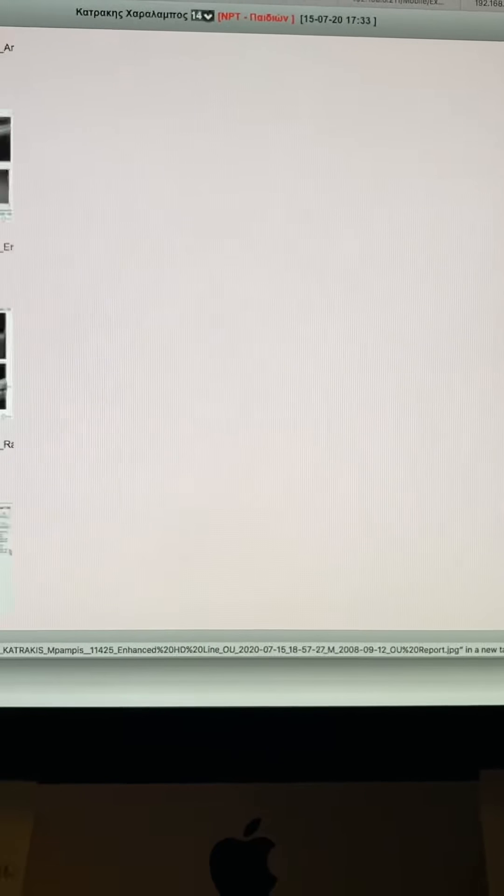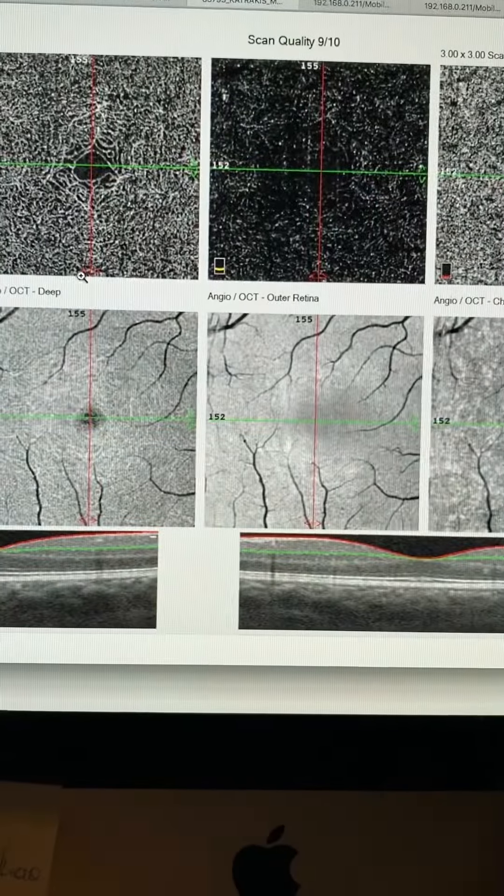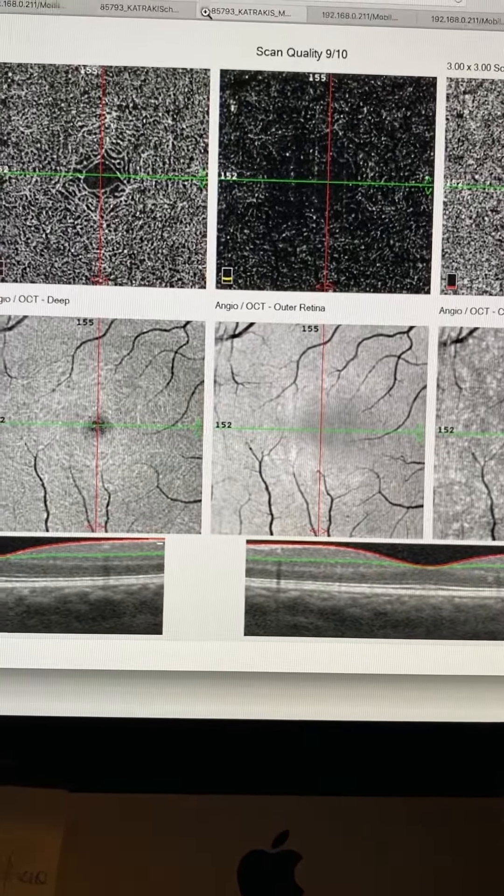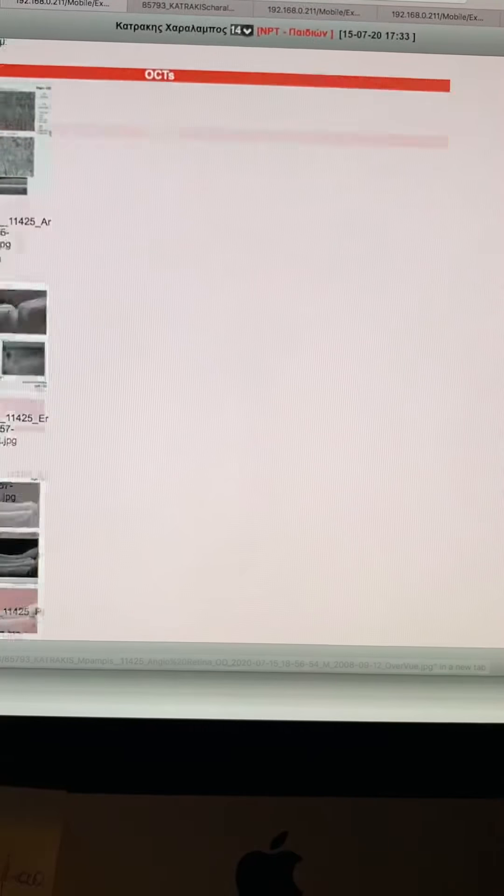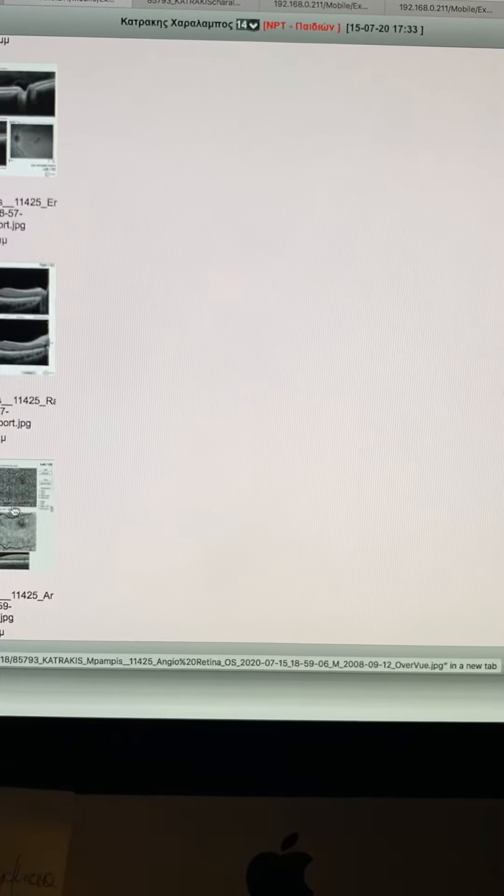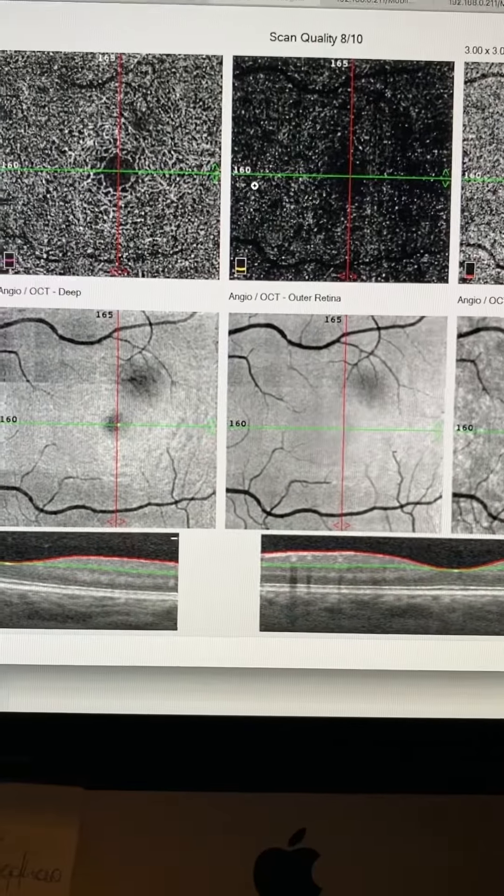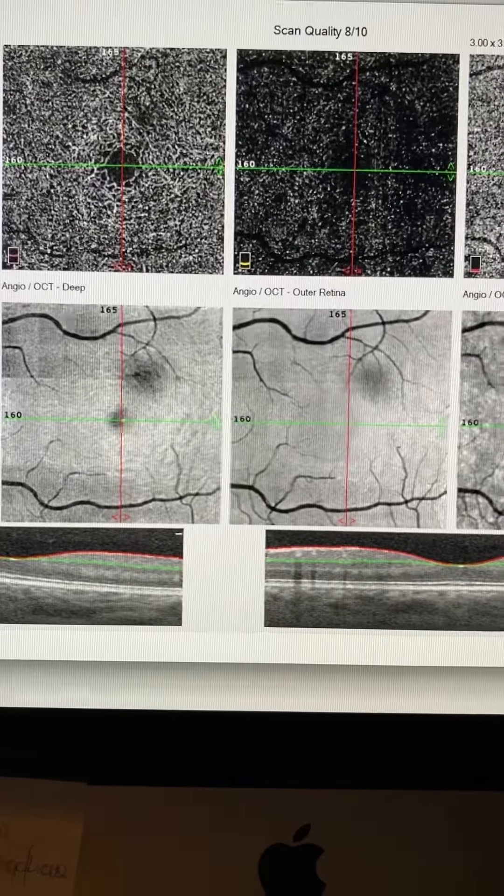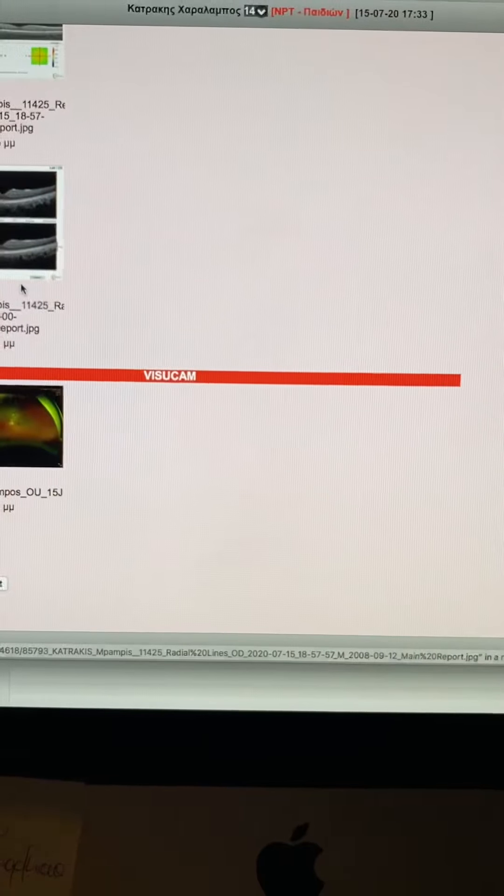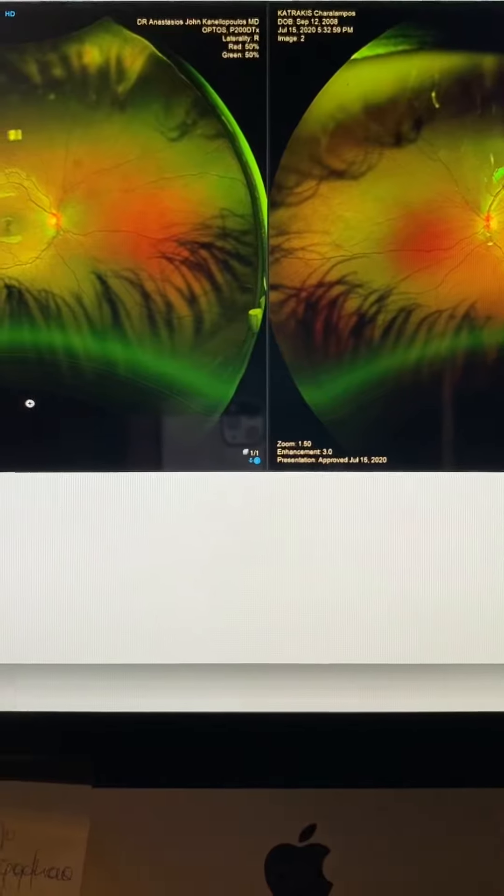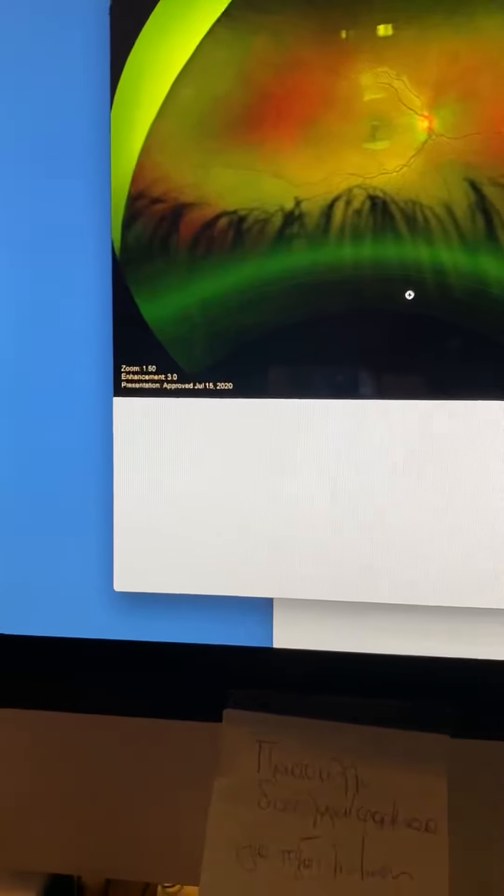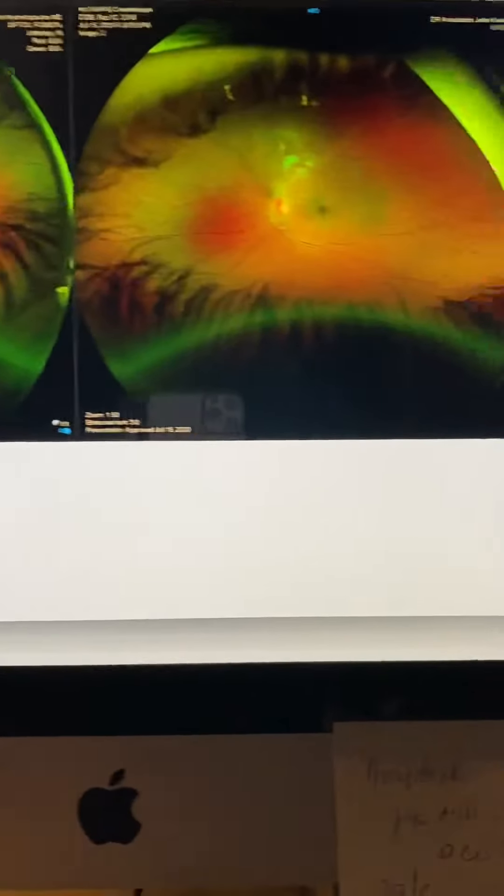For consultation, we went ahead and did the OCT angiography. As I mentioned, we'll do a brain MRI. This is the OCT angio on the left eye, actually normal. We'll do a brain MRI and an ERG to exclude any ocular pathology. And obviously, this is not an ophthalmologic problem.